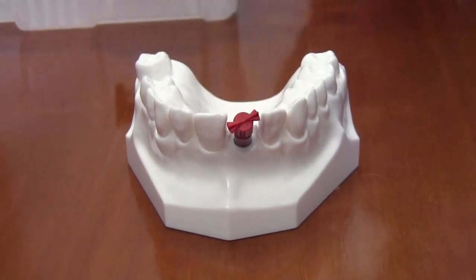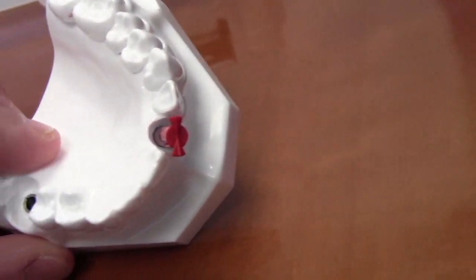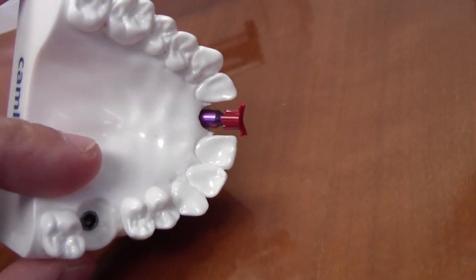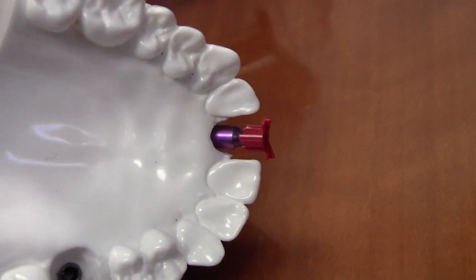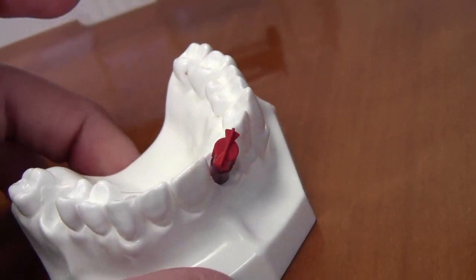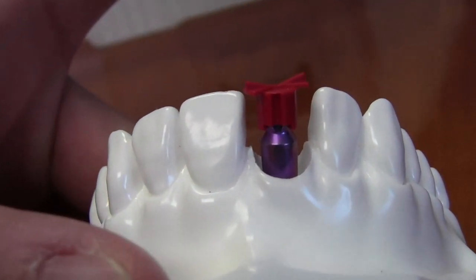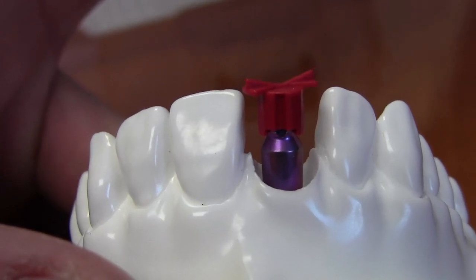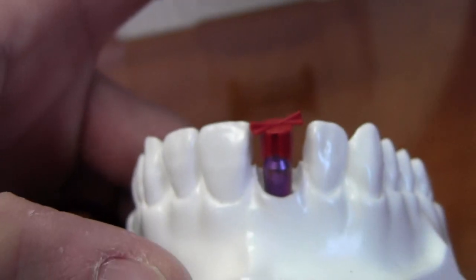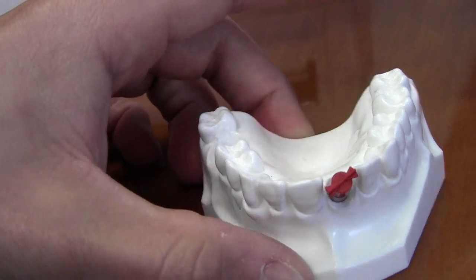Do you just leave it like that and put a crown over it? You can, but you could also prep it — I prefer the custom abutments. Now you said your lab could make a custom — well, you don't have to use that lab, I just used it as an example. I know there are other labs that make custom abutments. I forget the name, but one of them gave me a lifetime guarantee — if anything happens to that abutment, they'll replace the abutment plus the crown on top.